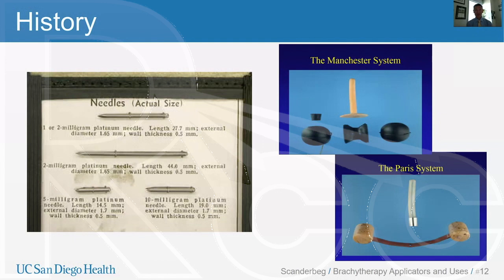It was then found that this caused the tumor to shrink, and hence radioactive sources continued to be used for the treatment of cancerous malignancies. Alexander Graham Bell, interestingly enough, was also said to have suggested the use of radiation in this manner to treat tumors. Radium was the isotope used in the early treatment of cancer in the late 1800s and early 1900s. In the following decades, radioactive radon gas was separated from the decaying radium and encapsulated in glass tubes, which were then used for cancer treatment.